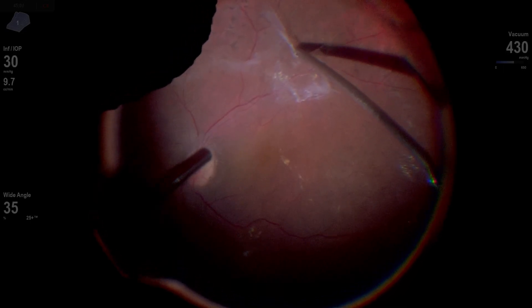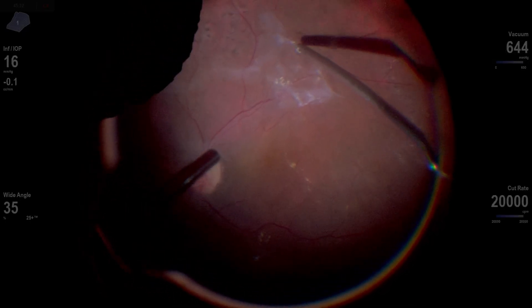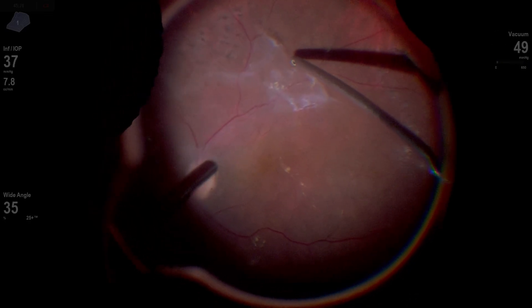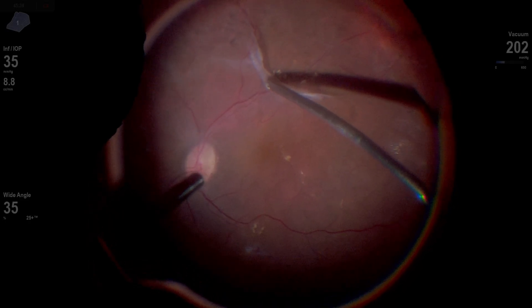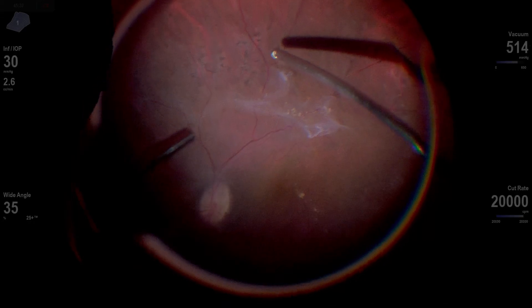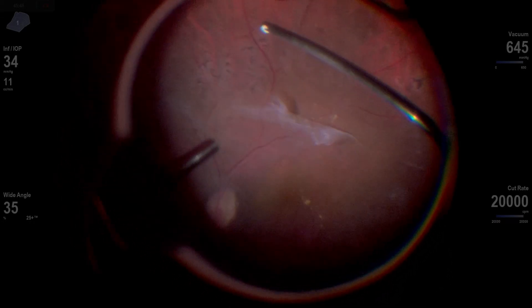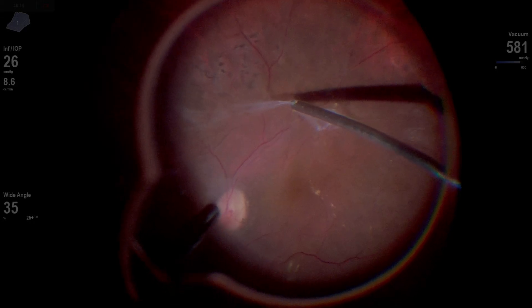Now I'm going to tackle this big plaque. Normally I work from the inside out — I try to find a plane and get this fibrosis elevated starting along the superior temporal arcade. But in this situation, the best access point I have is actually where I was able to get that vitreous up, so I'm going to work right along that area more peripherally. I'm lifting and just trying to create any space to get my 25-gauge bevel cutter in there. This is a huge blow for freedom from this fibrosis as I'm able to elevate that plaque and reflect it back on itself. When you start to get something like this up and see some pulling on the retina, stopping and going back to core vitrectomy and letting fluid do some of the work can be really essential.